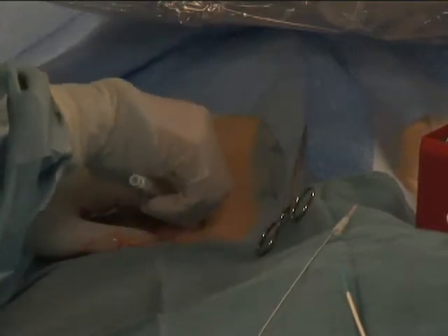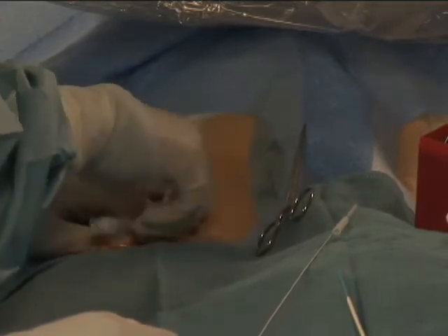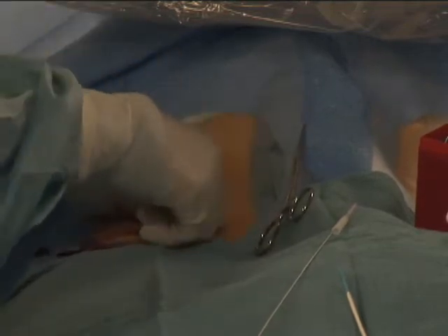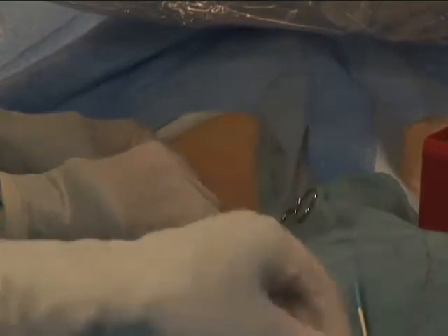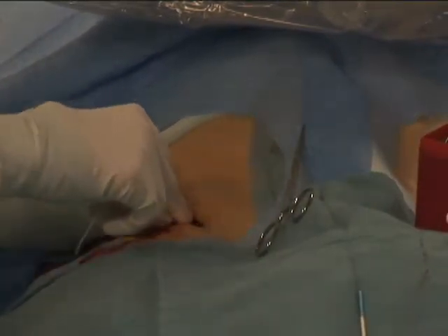The needle is stabilized and the microwire is advanced through the needle and into the vessel where it is visualized under fluoroscopy to advance into the distal aorta, thereby verifying that the wire is not entering any accessory vessels branching off of the femoral or iliac arteries.